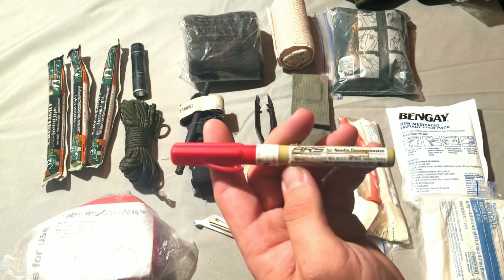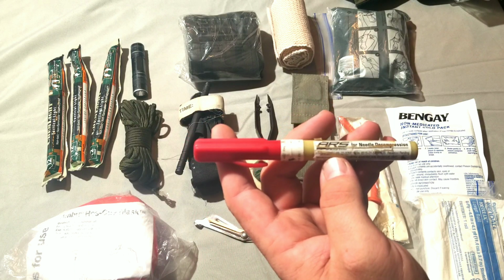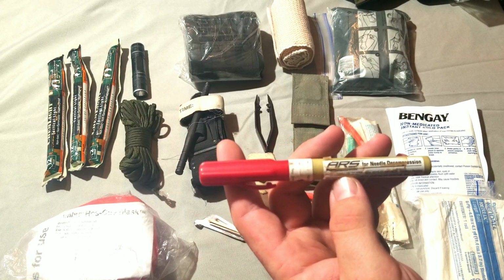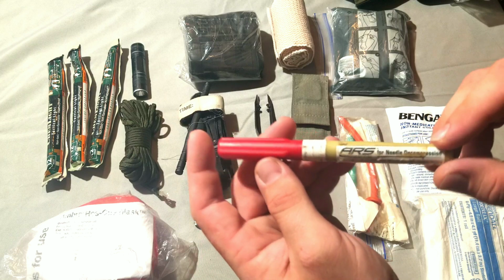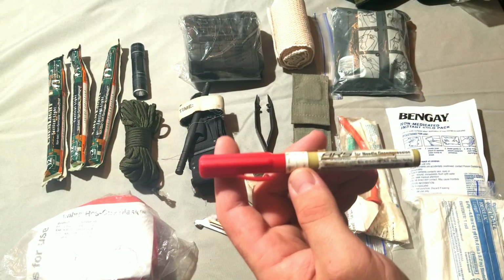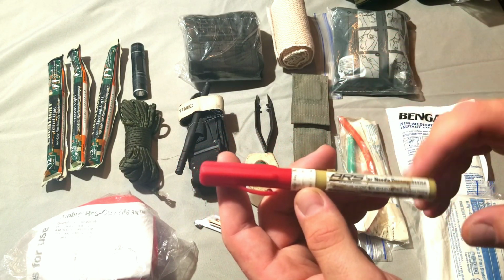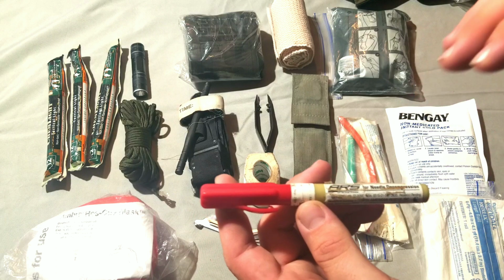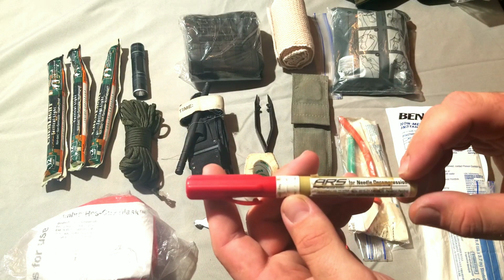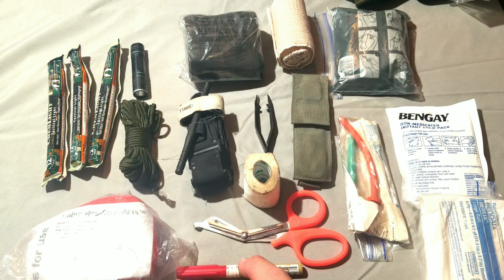But once again, this is something that you should be trained in before attempting. Can you carry it? Yes, maybe somebody will know how to use it, but get yourself formalized training on this. You can do ALS courses that can get you trained on this, even if you don't want to be a paramedic or anything like that. But once again, make sure you know how to use it properly before you wind up damaging a victim's lungs even more. So you can't just go sticking a needle in anywhere. So that's just another item that's on the list of make sure you're trained proficiently in that.